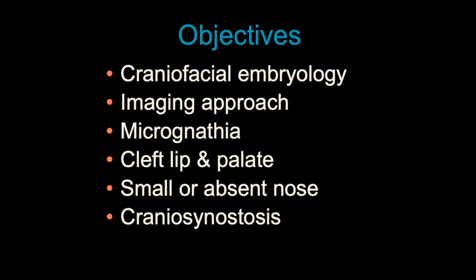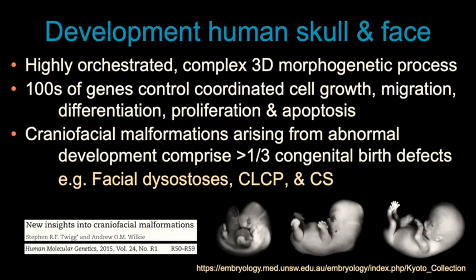In this talk, we will briefly review craniofacial embryology, discuss an imaging approach to craniofacial disorders, and then review 4 major topics: micrognathia, cleft lip and palate, small or absent nose, and craniosynostosis.